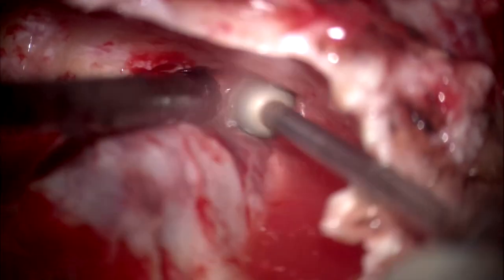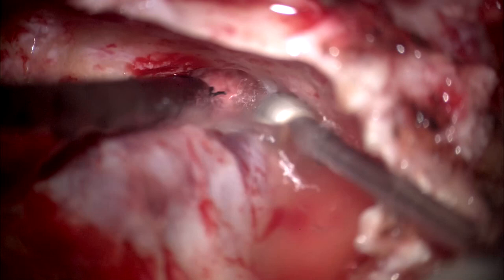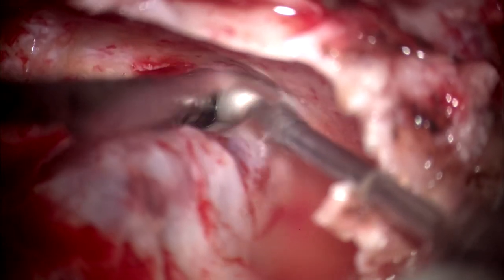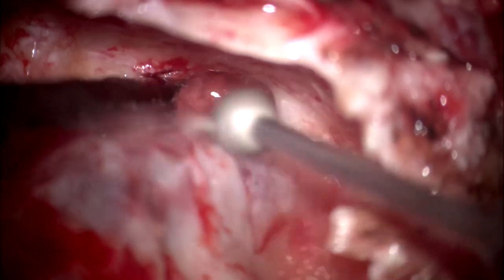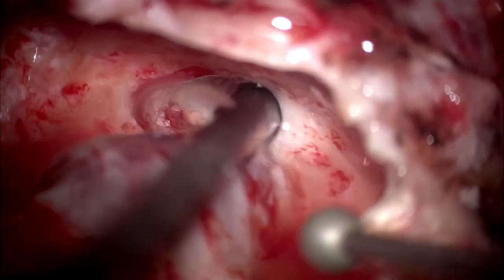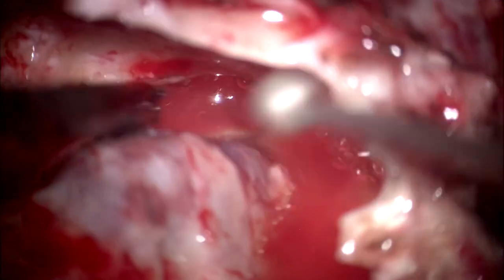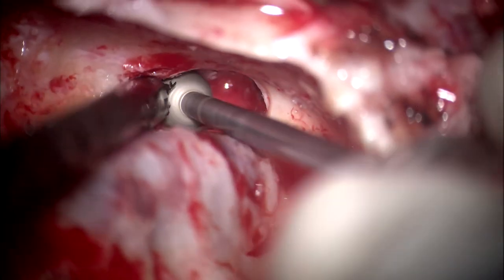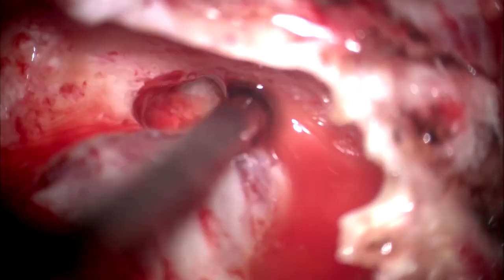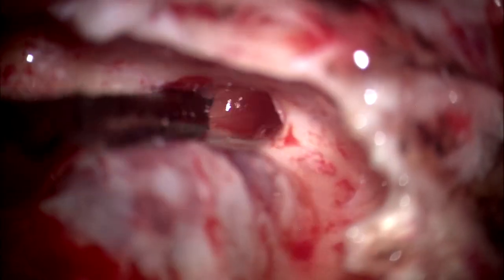What I am trying to define is my lower limit there. See the jugular bulb below. See the blue hue of the jugular bulb below. See that? Can you see a glimpse of that? Yes, sir. That is the marrow bone below, that is not cellularity.